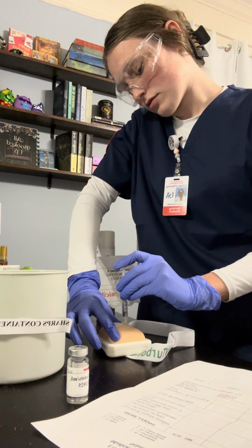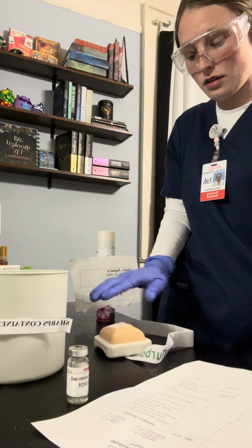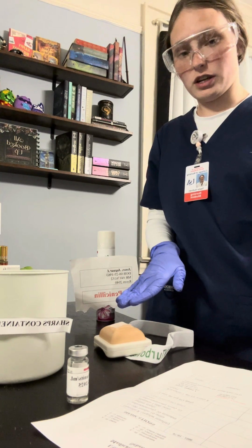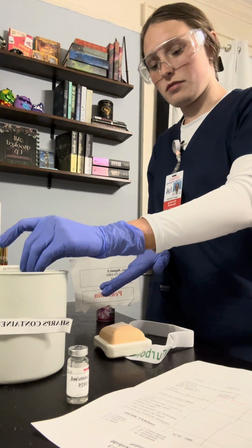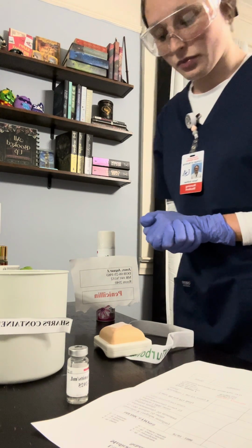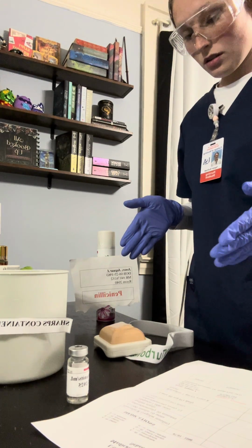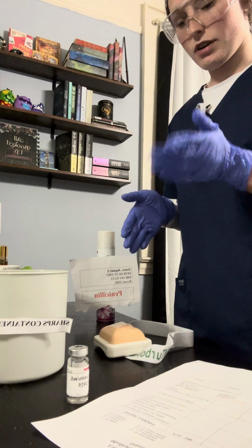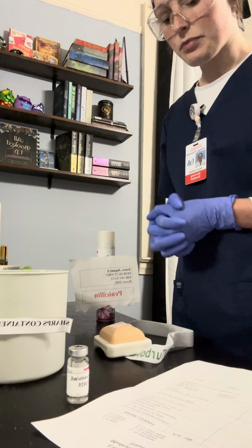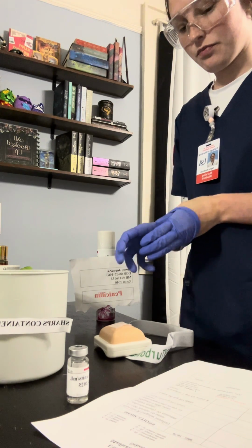Okay, so now I can take the needle out, and then I would place the alcohol swab on top of the injection site, throw this in the sharps bin. Okay, so I would raise the side rail and then lower the patient's bed and place him comfortably, and I take my gloves off.